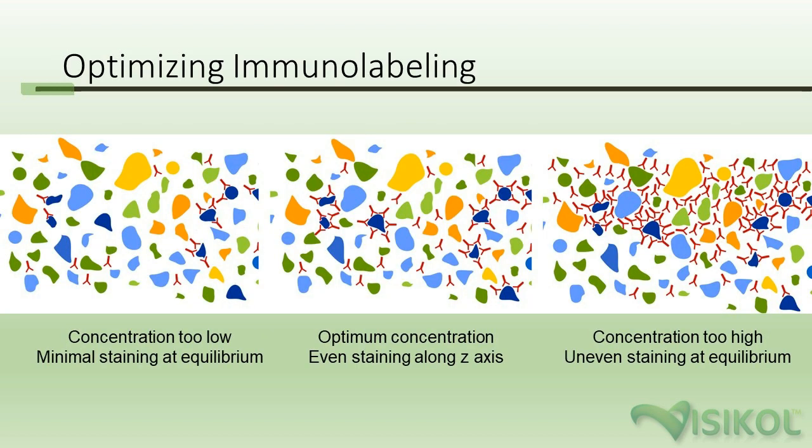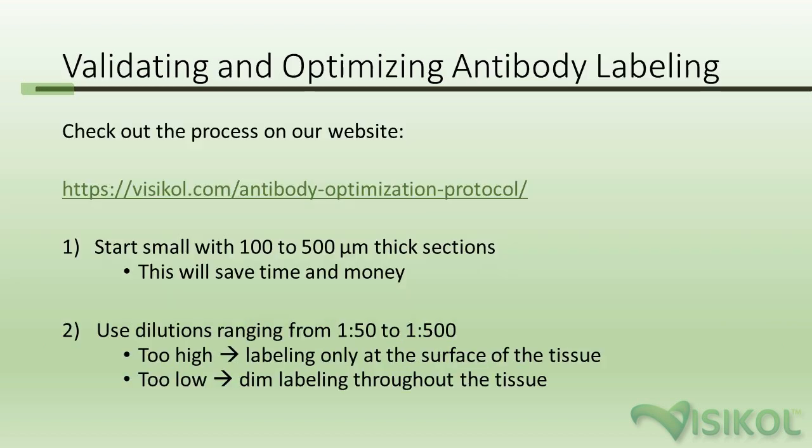Optimizing immunolabeling is a balancing act — you don't want to go too low or too high. Going too high on concentration means antibodies will tend to get stuck on the outside of your tissue, creating a dense ring around the periphery with no labeling in the interior. Use dilutions between 1:50 and 1:500 and optimize based on whether labeling is only on the surface or very dim throughout. You can find a step-by-step antibody optimization protocol at visikol.com/antibody-optimization-protocol.